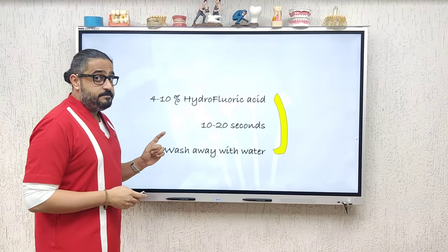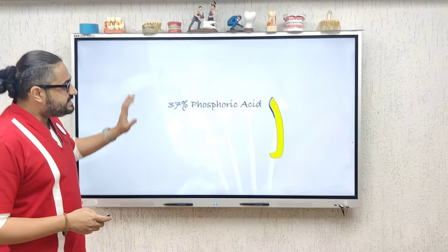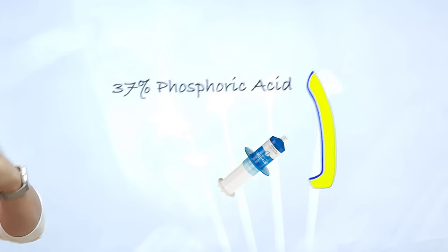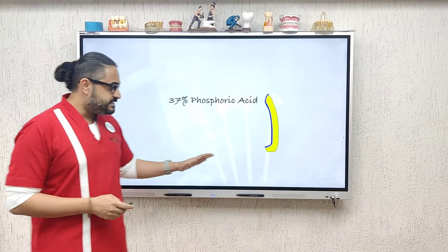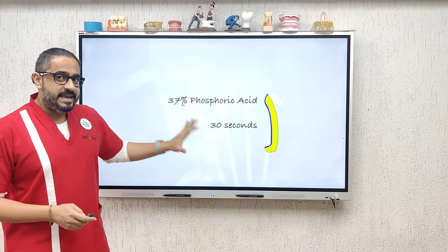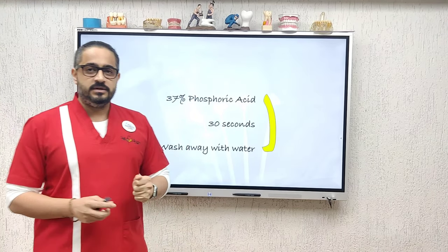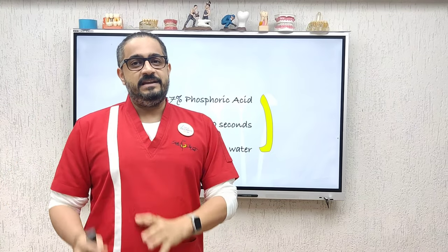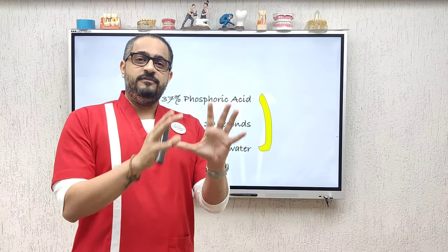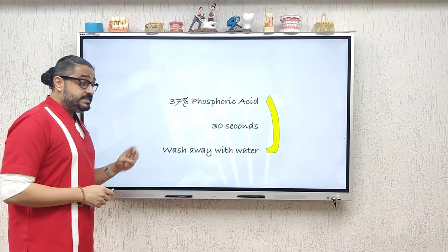Now comes another simple yet important step. Go ahead and take your 37% phosphoric acid — your regular tooth etchant — and apply it onto the entire intaglio surface. Leave it there for 30 seconds, then wash it away with water. This takes away all the dissolved lithium disilicate crystals, leaving a beautiful frosty surface ready for bonding.